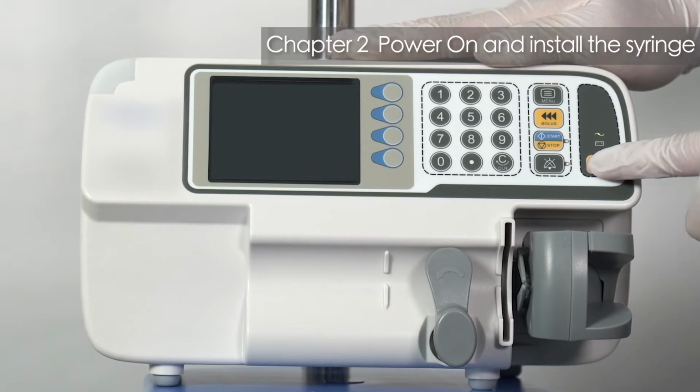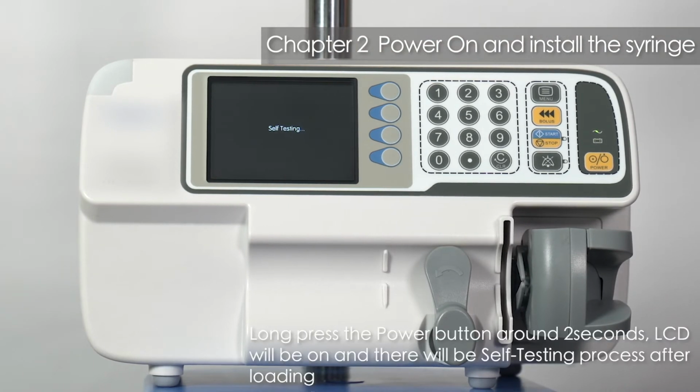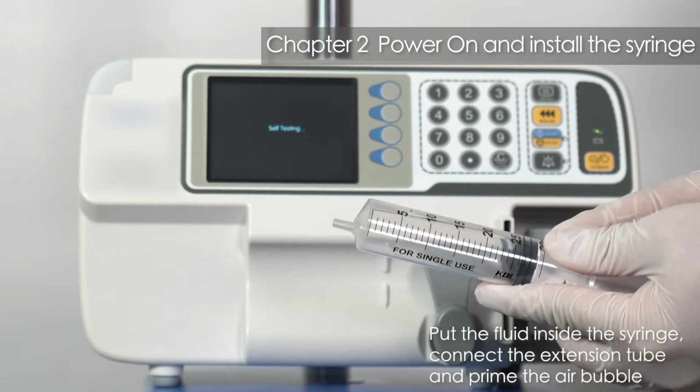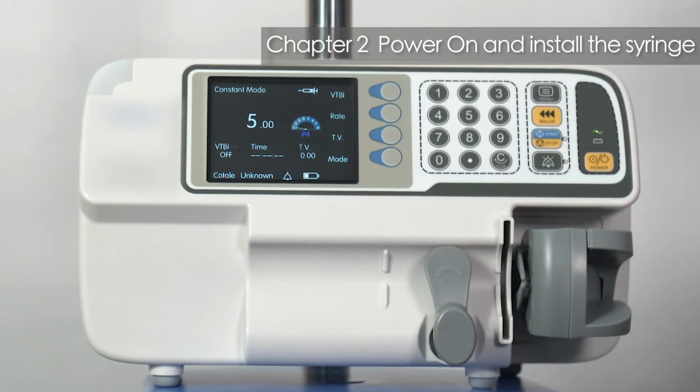Chapter 2. Power on and install the syringe. Long press the power button around 2 seconds. LCD will be on and there will be self-testing process after loading. Put the fluid inside the syringe. Connect the extension tube and prime the air bubble.